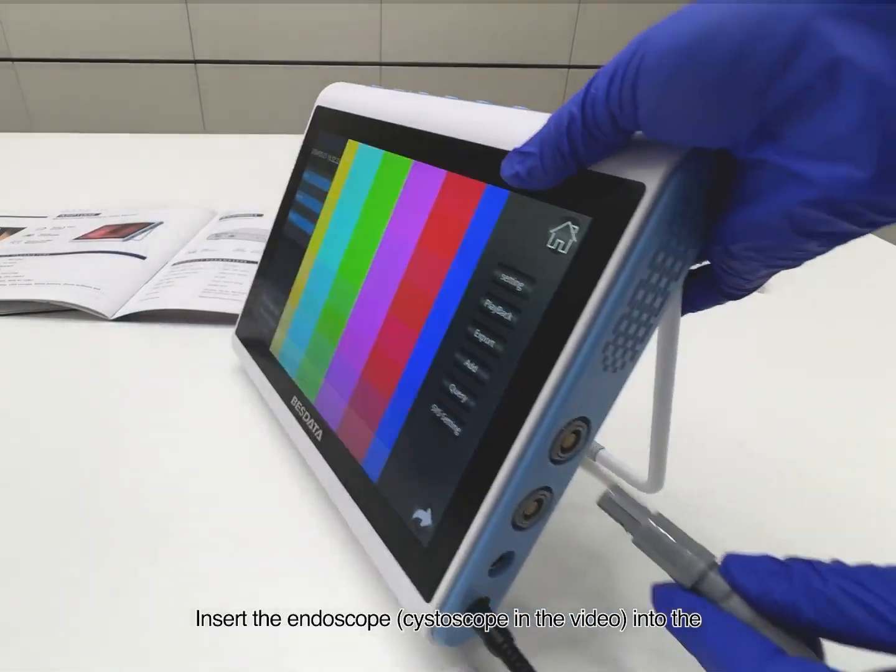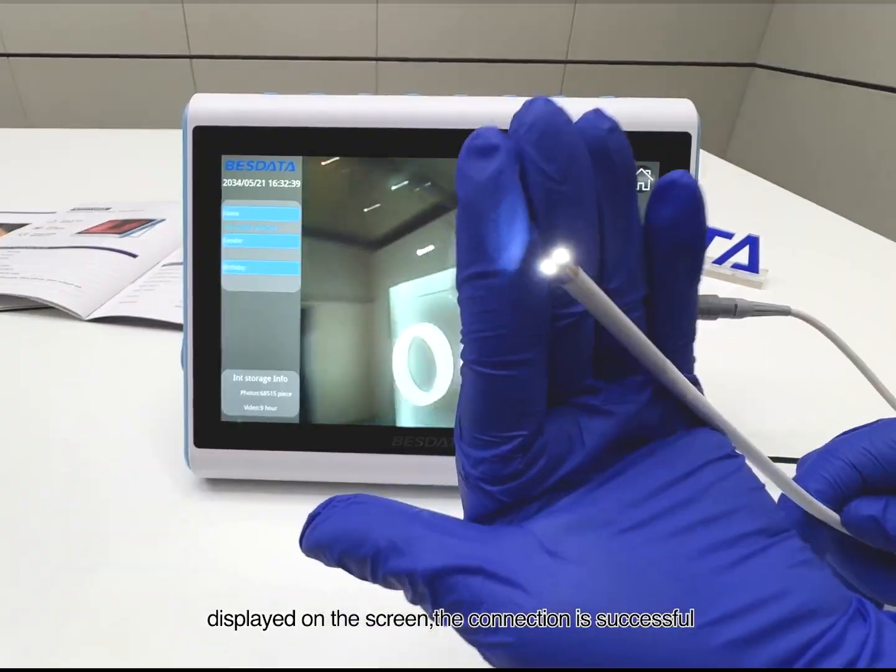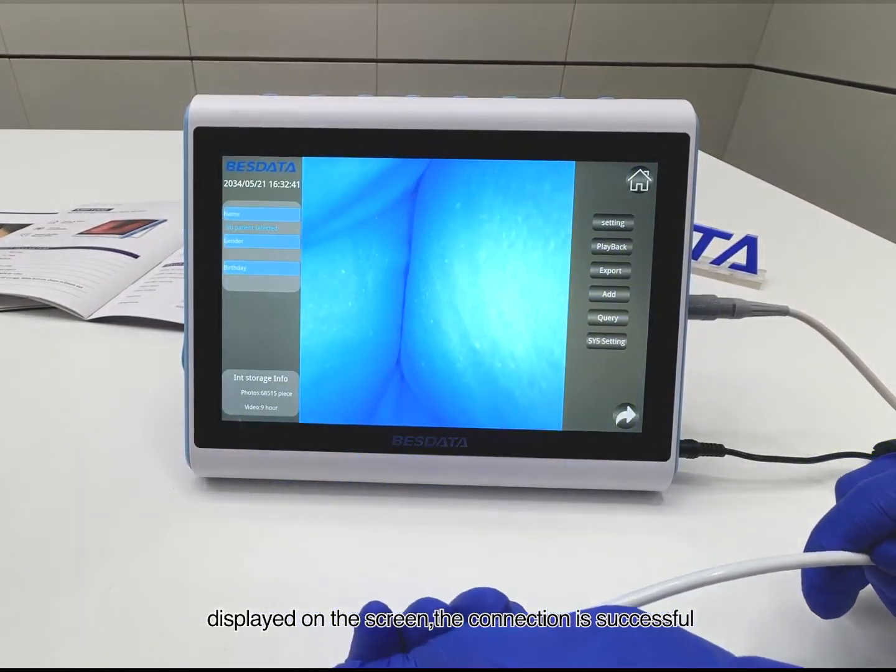Insert the endoscope, cystoscope in the video, into the corresponding port. When the endoscope end lights up and image is displayed on the screen, the connection is successful.